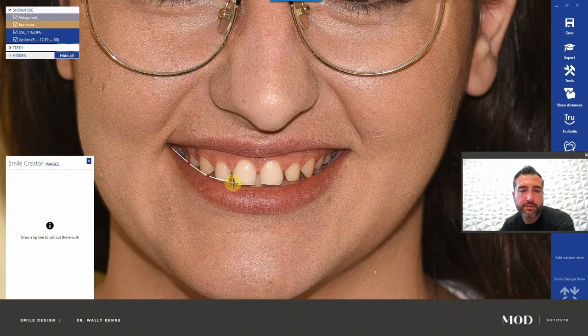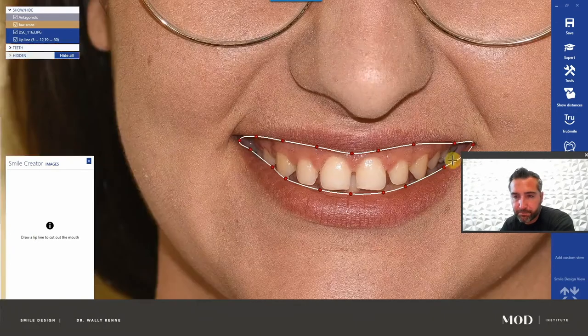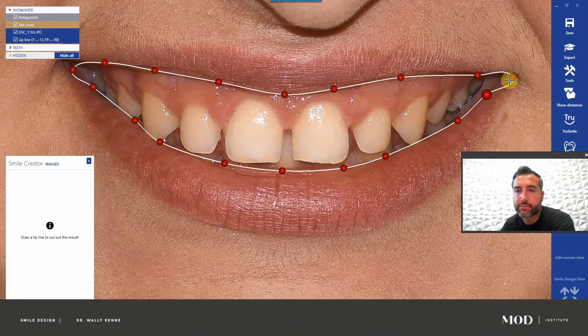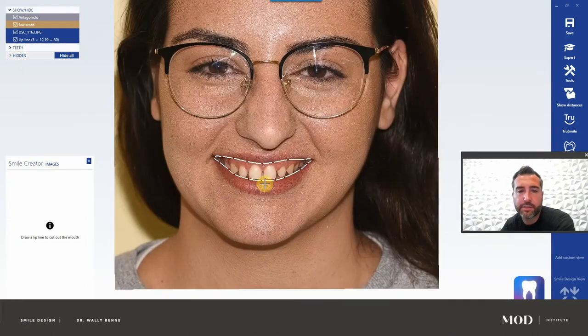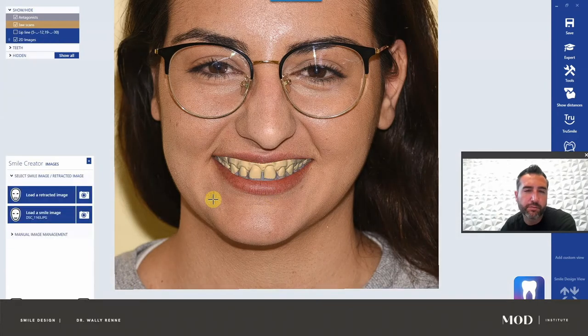Now it's asking us to draw the lip line — basically just circle the lip, being super careful here. You can add points by double-clicking and you can click any ball and move it. Take your time. Over here you have to add some more balls so you can follow the asymmetries and curvature of the lip. If you want my personal philosophy on what I'm looking at with this case as I go through it, look at the first video.